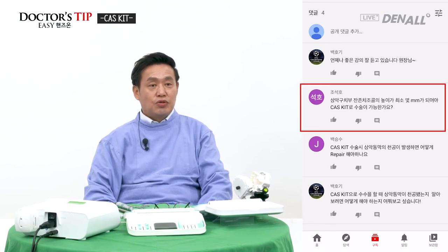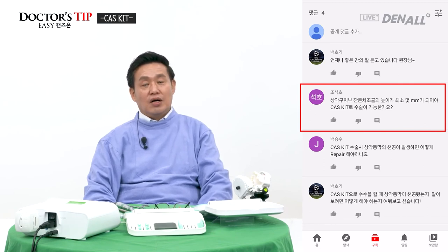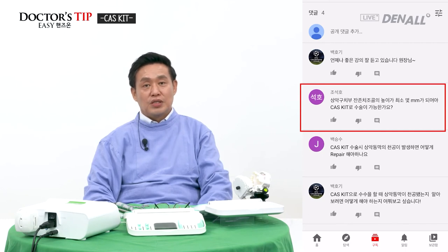What is the minimum height of residual bone in the upper posterior to do surgery with a CAS kit? In the past, we determined the lateral versus crestal approach depending upon the height of the residual bone of 5 millimeters. If the residual bone is higher than 5 millimeters, crestal approach. If it is lower than that, lateral approach.